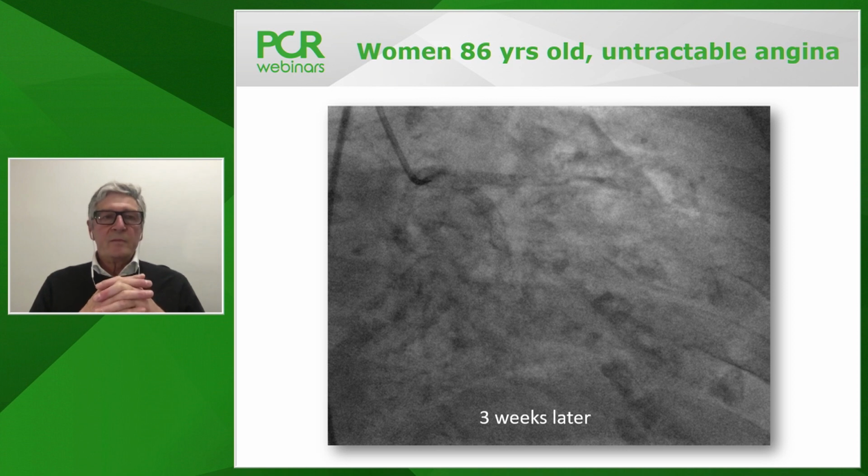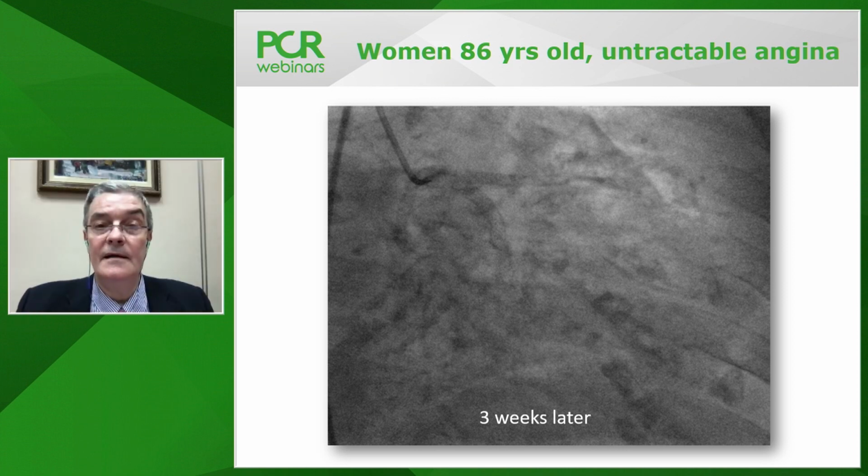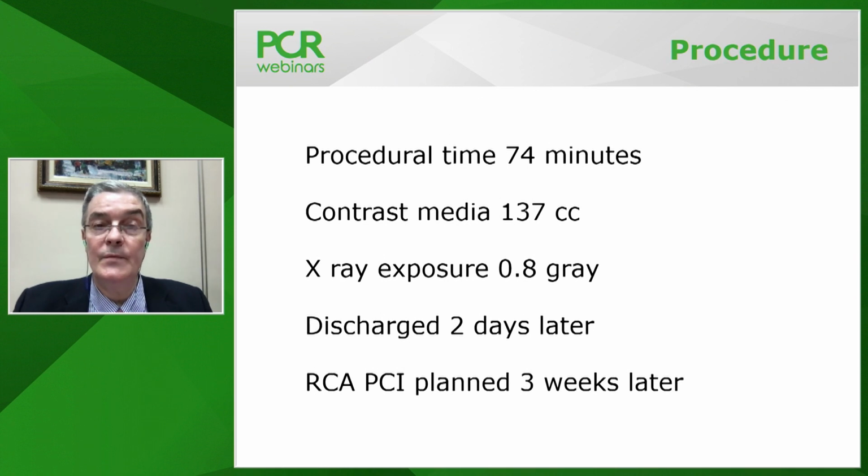Prof. Tan, do you have any comments regarding lesion preparation? Would you do something different? So Thierry decided to do non-compliant. As we see, there was full balloon expansion, and he decided to stay with NC balloons. Would you still use imaging before rota? What would be your strategy?